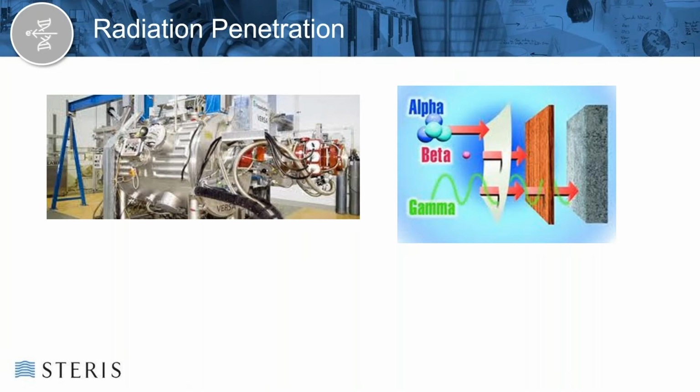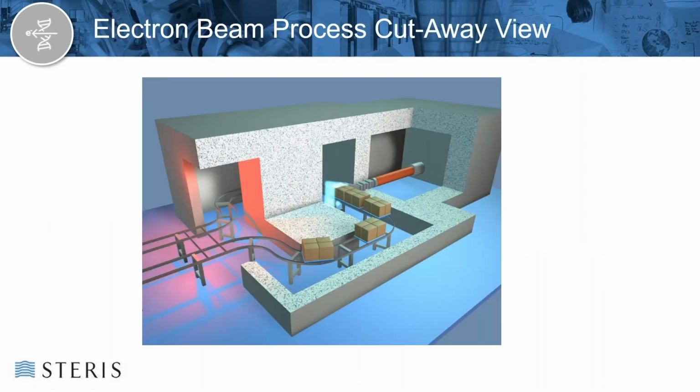For all of our processes, we have shielding that protects us from radiation. As you can see, for an alpha particle, it certainly doesn't take a lot of shielding. A piece of paper can do it. And our processes don't use alphas. Alphas are present in laboratory environments for radioactive isotopes, but they're not something that we would use for industrial processing, whereas betas or electrons are, as are gammas that we use for sterilization purposes.